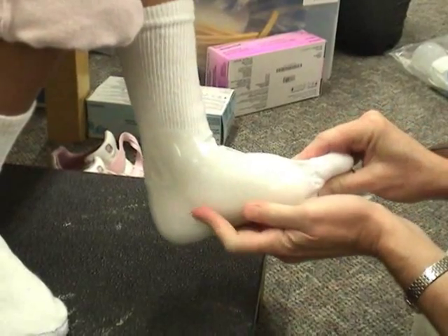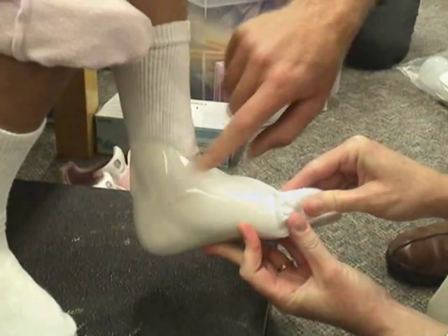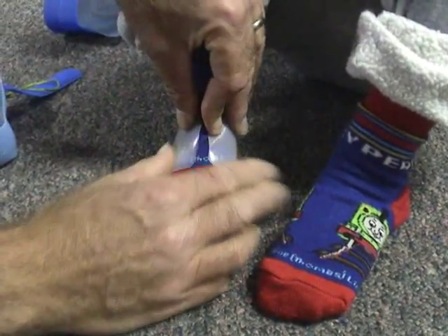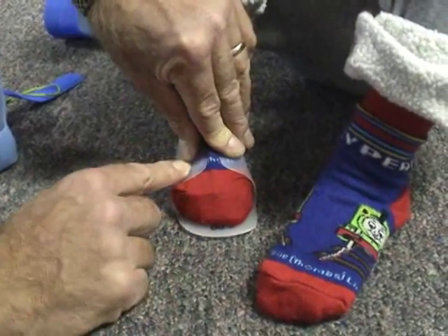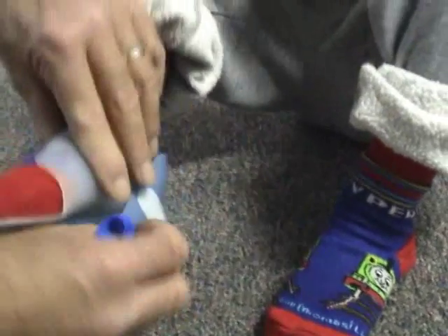Lastly, I look at the overall conformity of the surfaces of the brace to the patient's foot. Be aware that the jumpstart will be compressed by the shoe, and so applying mild compression with your fingers to mimic the shoe can give you a better visual approximation of how the jumpstart is actually fitting.